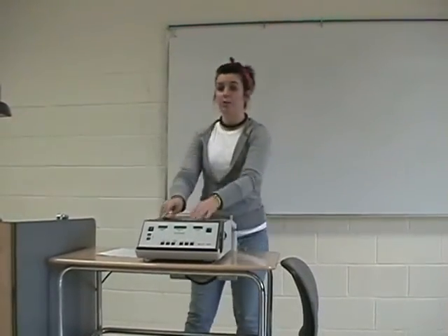Now it's time to put away your pure tone audiometer correctly. Always make sure you turn it off first. Then you wrap up the cord around the headphones so it does not tangle. Place them in the audiometer. Then you unplug the audiometer.